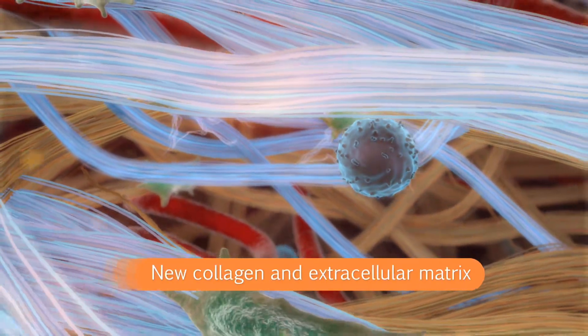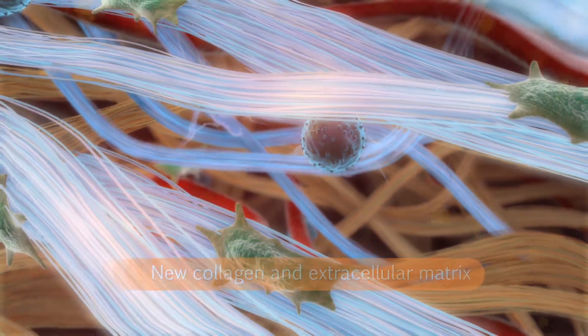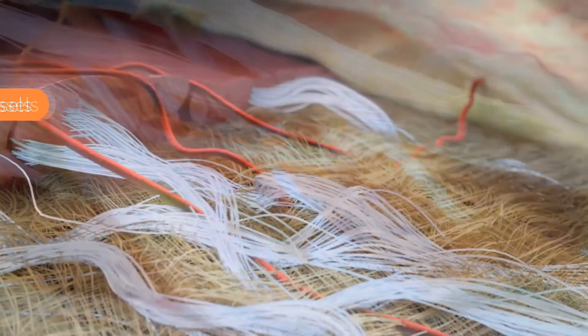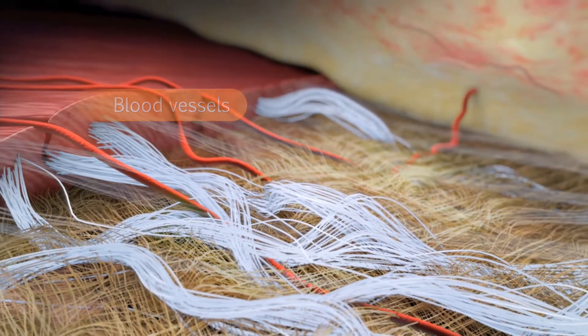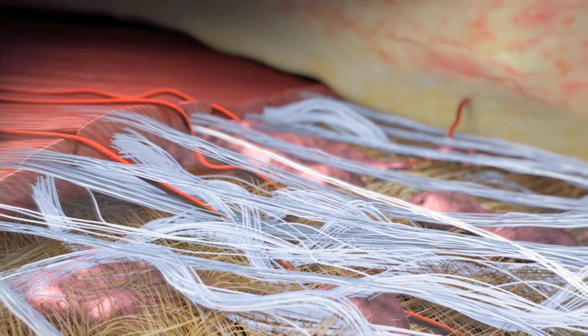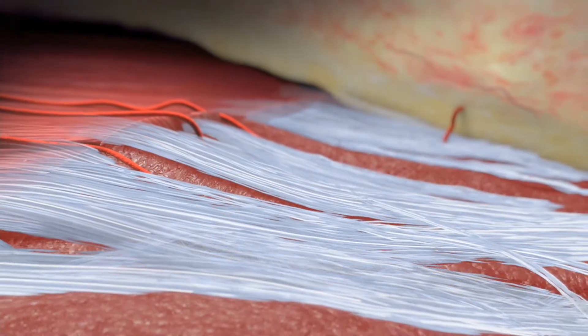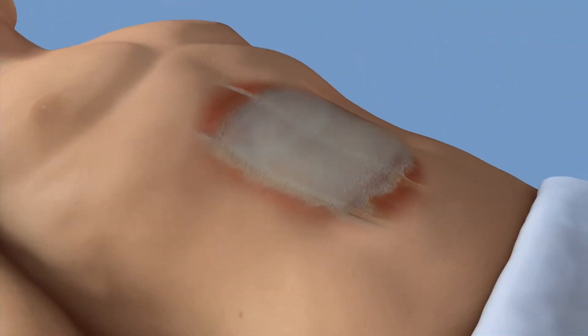This leads to the remodeling of the reconstructive tissue matrix and ultimately the regeneration of the soft tissue. The transition from Stratus reconstructive tissue matrix into host tissue restores the physiological and anatomical properties of the surgical site.